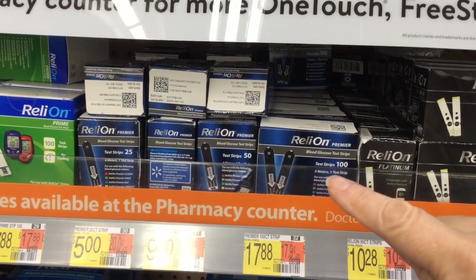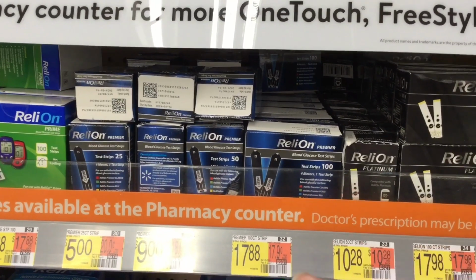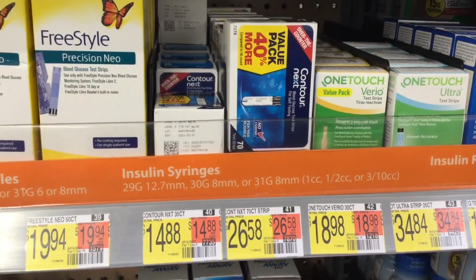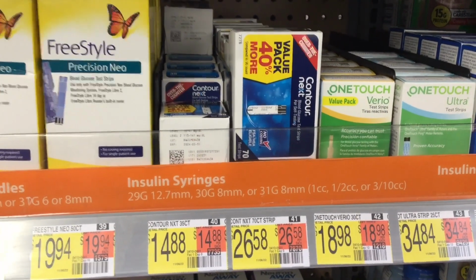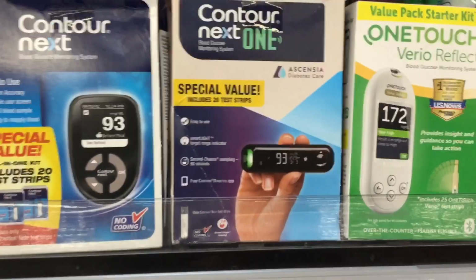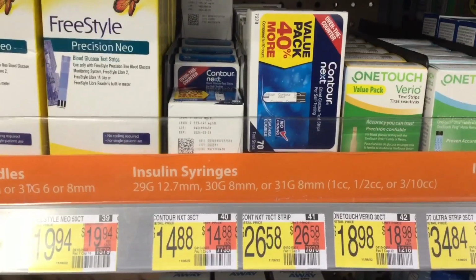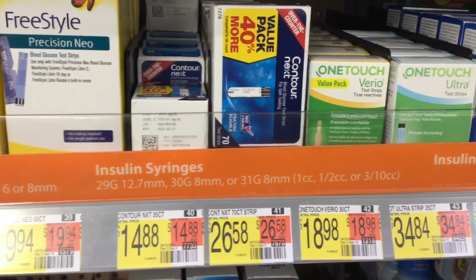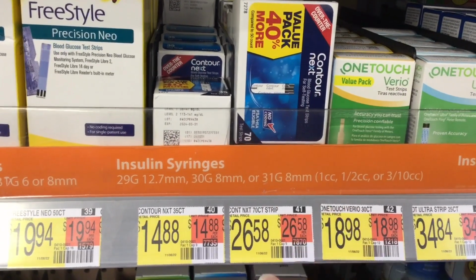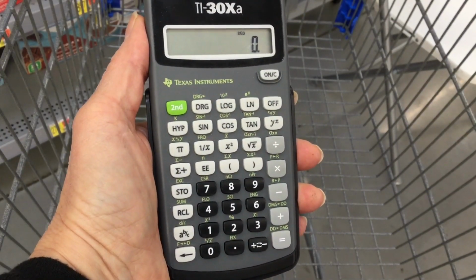Now this one has a box of 100 test strips for $17.88, and because there's 100, it's easy to figure out that that's 17.9 cents, 18 cents a test strip. The test strips for the Contour Next brand meter that goes with the Contour Next One kit, see that kit right there, don't come in a box of 100, they come in a box of 70. Now this price is a little bit misleading if you look at the price per test strip, because that's not 100 test strips, that's only 70, and the box will cost you $26.58. So it's important to pay attention to that detail.